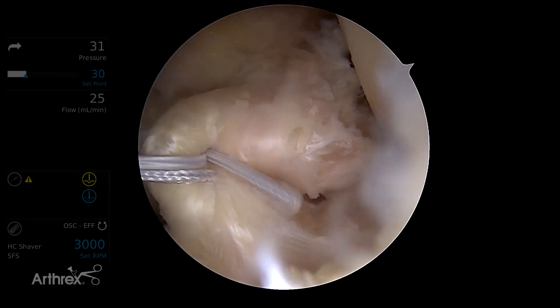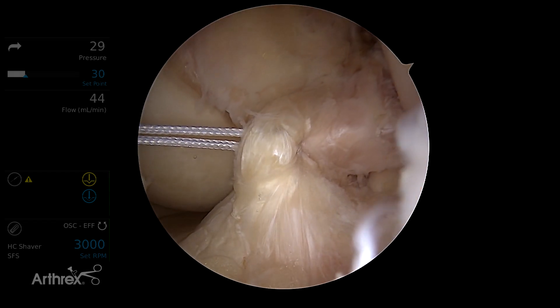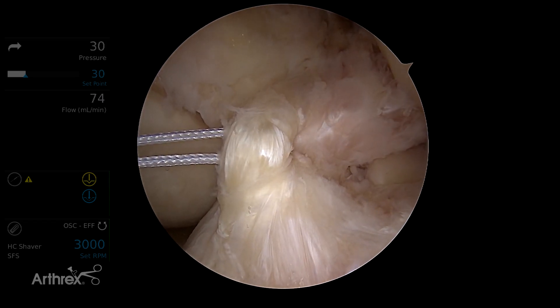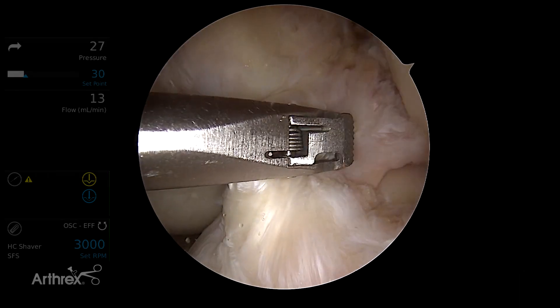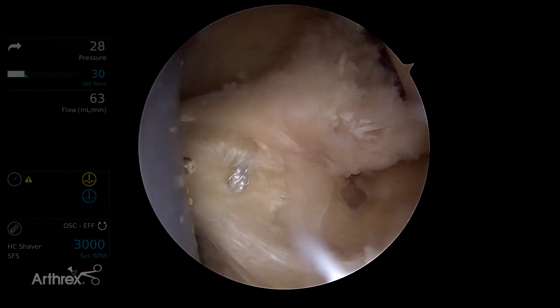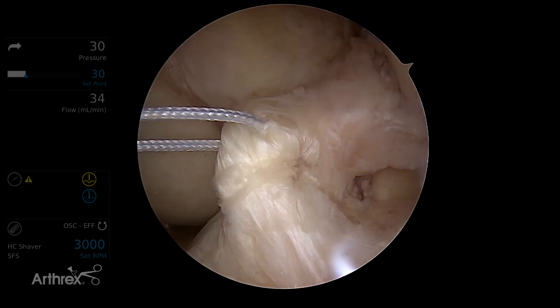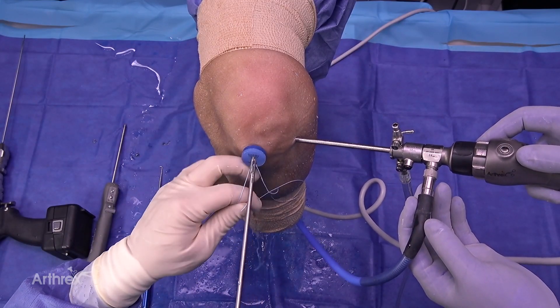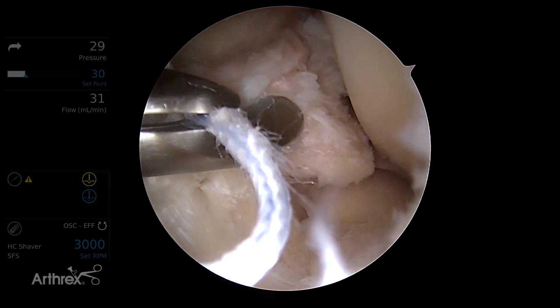That's our first pass going the other way. You want to make sure you don't get tangled, so when you lock it in there go a little slow. If you see that you're caught up on your other limb, you can always go in and untangle yourself. We're going to come back the other direction. One important thing is to feel the resistance on the needle before you buy it — you're going to avoid coming through your other sutures and transecting a suture already passed. If you do feel that resistance, stop, pull out, re-situate yourself, and re-angle your next pass.